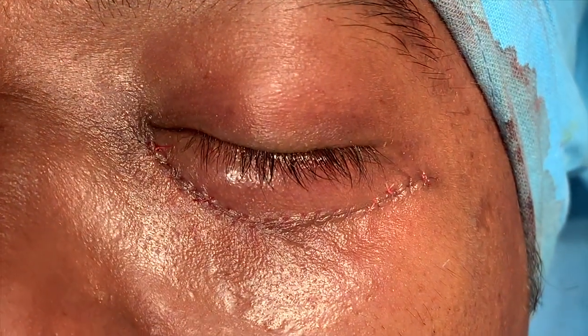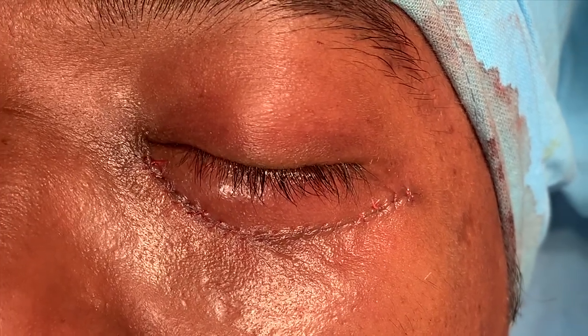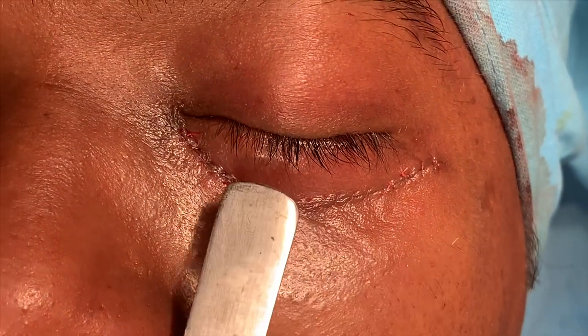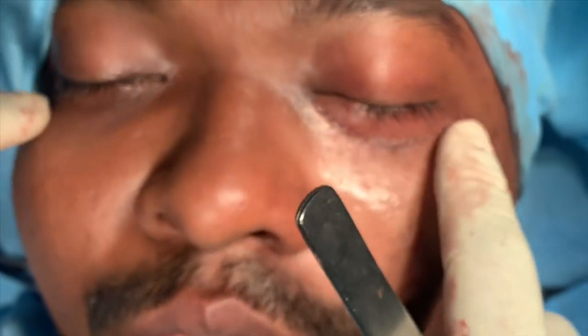Just completed suturing. I used this approach because the earlier surgeon had used the same scar to approach the orbital floor and infra-orbital rim. After reconstruction, I've got a muscle layer closed inside. You can look at the other side and see the symmetry — there's a similar hollowing on both sides now and the globe is almost in a similar position. I think we've got excellent reconstruction of the orbit.